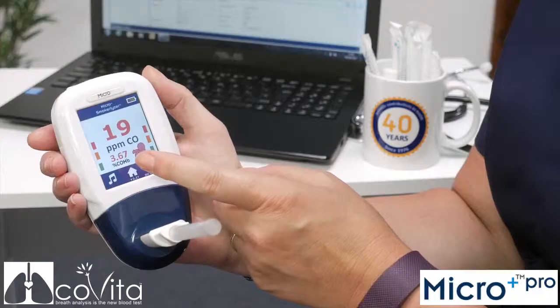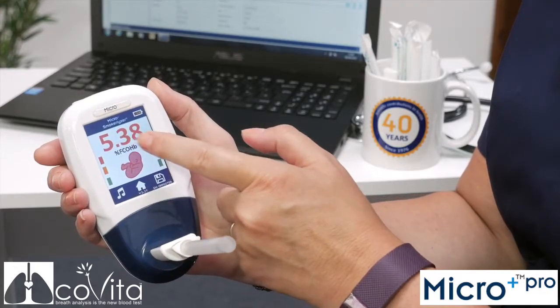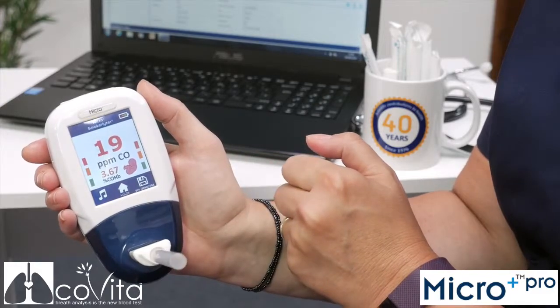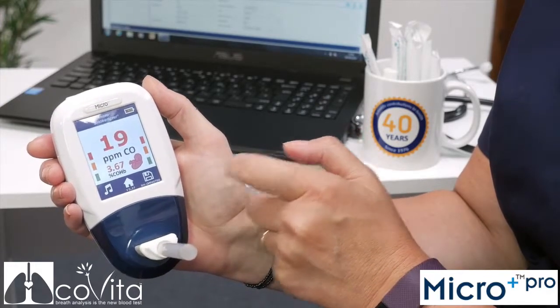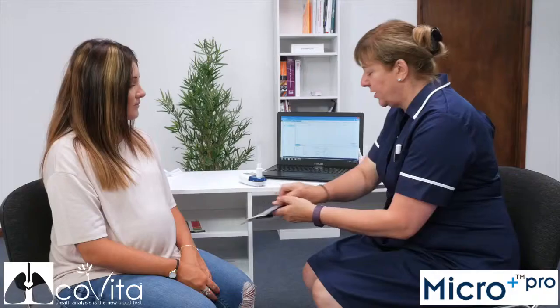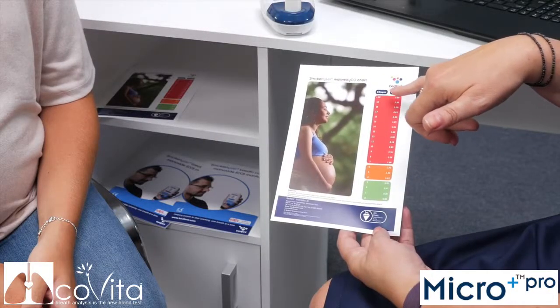Click on the baby icon to see the CO fetal calculation. Click the icon again to return to the results screen. When the test is finished, you can save the reading to the patient's profile or return to the home screen. Readings and results can be interpreted using the maternity Smokerlyzer CO chart.